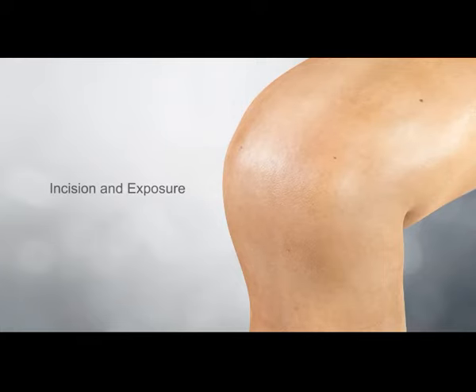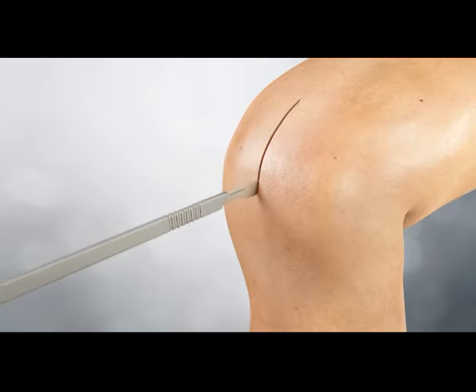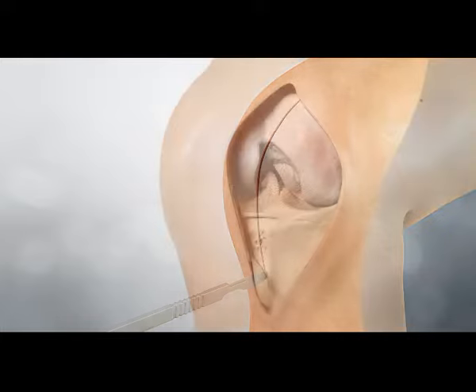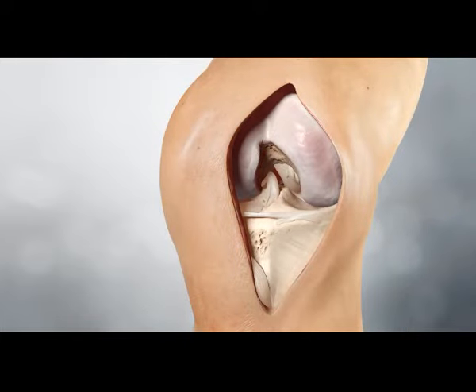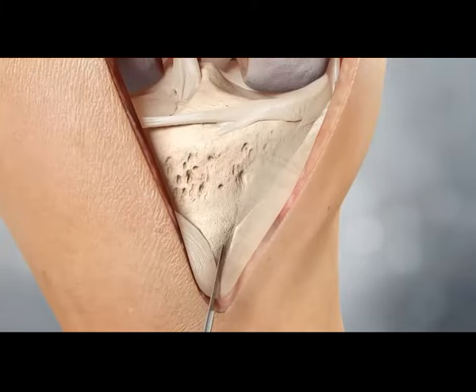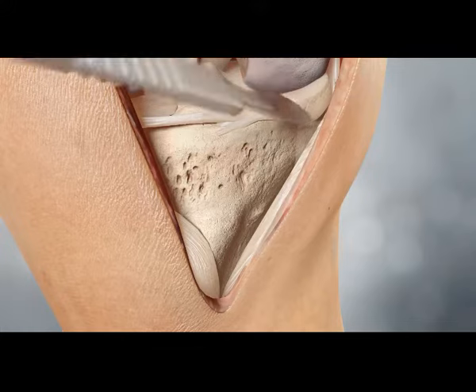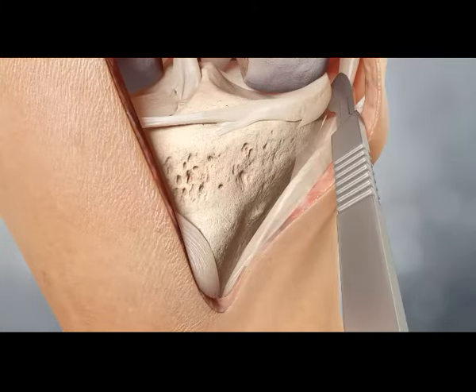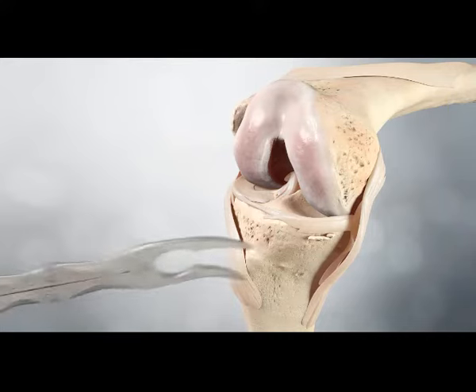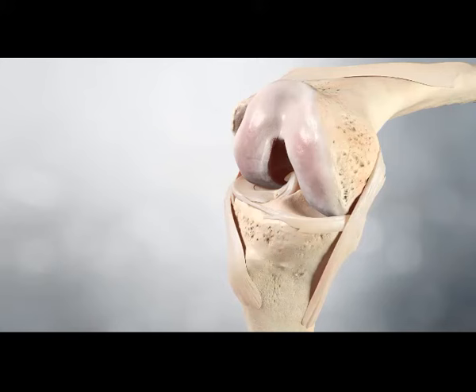Incision and exposure are performed using the surgeon's preferred technique. The instruments are designed for both standard and minimally invasive approaches. Any hypertrophic synovium is excised along with a portion of the infrapatellar fat pad to allow access to the medial, lateral and intercondylar spaces. Prominent osteophytes, particularly medial and lateral osteophytes, are also removed as they can affect soft tissue balancing.